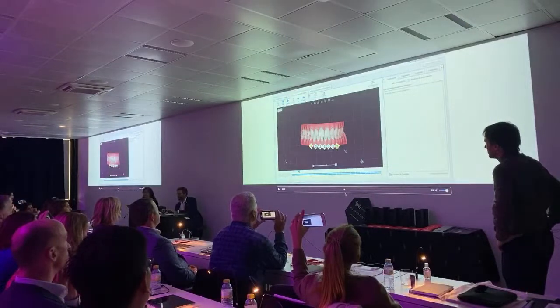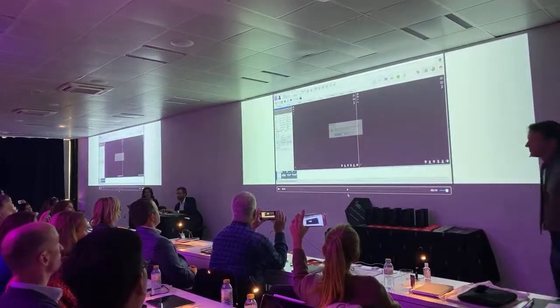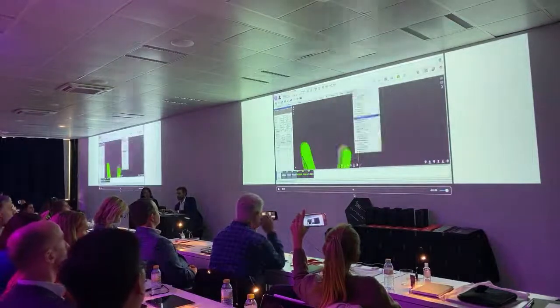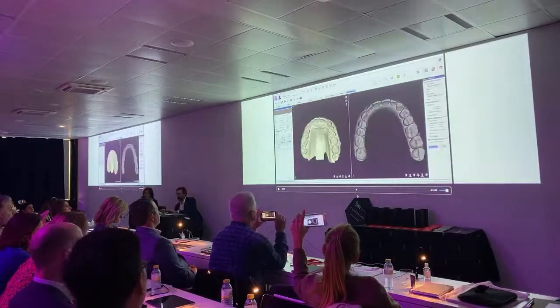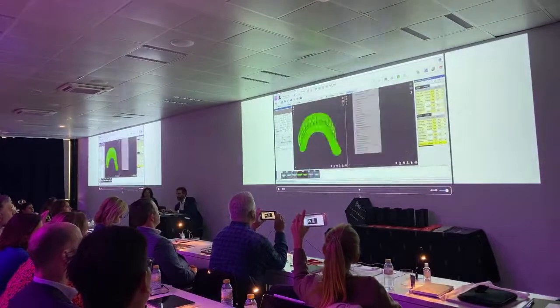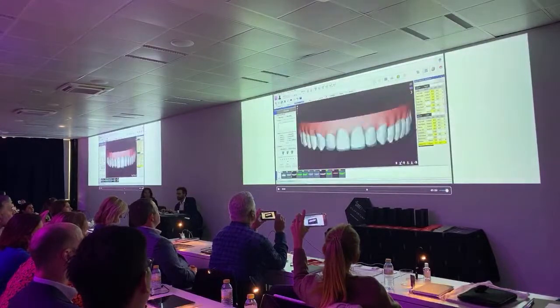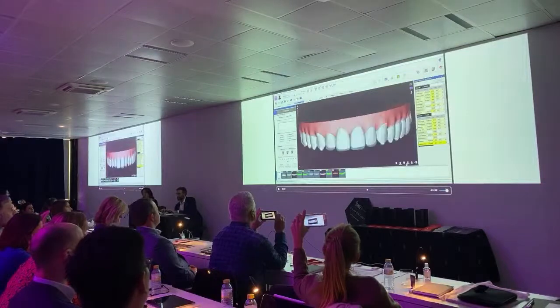So we export the STL files and we upload into our software, Nemotech. Then we overlap this information with our previous information, the design and everything. And we will quality control. So we have our own little CleanCheck inside Nemotech. We're gonna quality control.